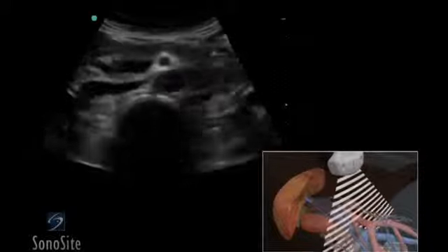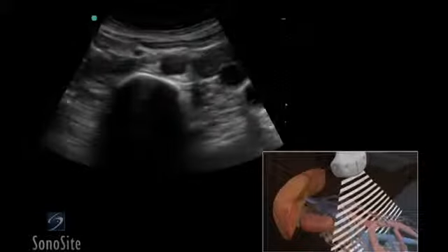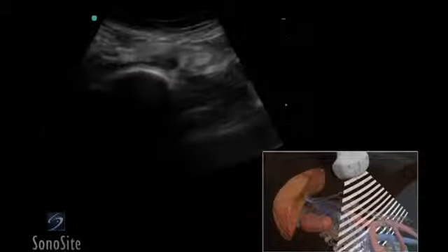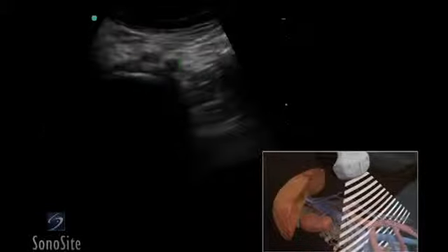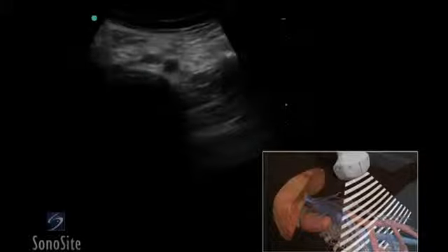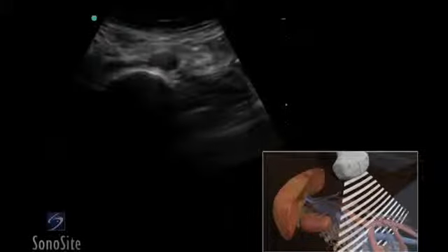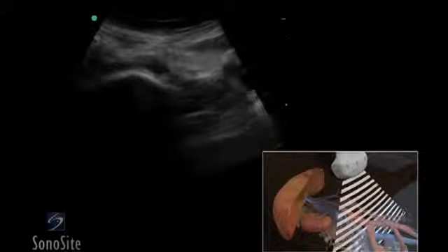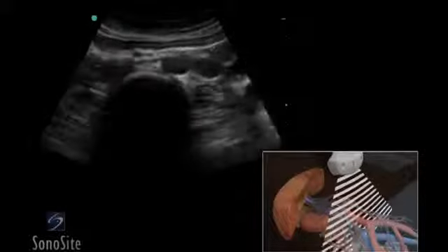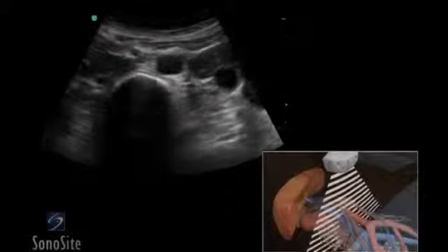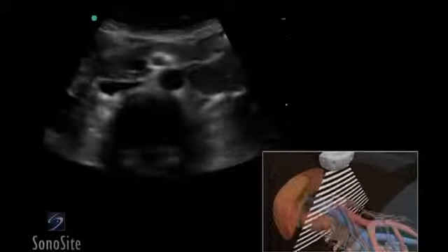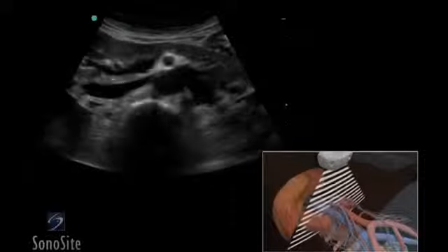Continue distally to the bifurcation of the iliac arteries. Note the location of any change in size of the aorta or iliac arteries, and measure in long and short axis views from outer wall to outer wall to determine the true diameter.